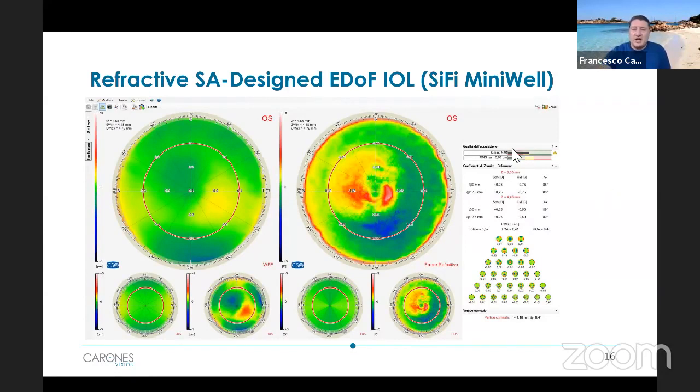You see here how the central part is set to be slightly transferring the light to the myopic side, so giving more on the minus side, while the mid-periphery is more on the opposite side, so giving a little bit of hyperopia. So again, why is it so interesting?